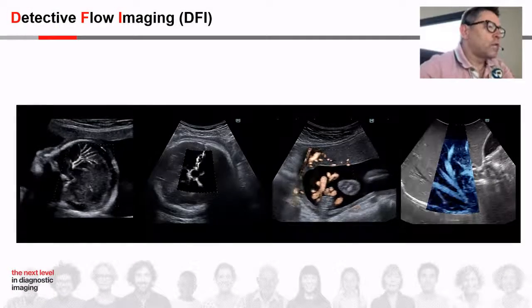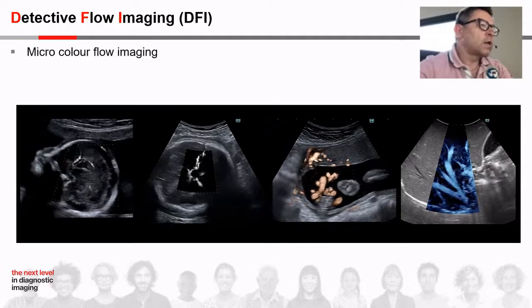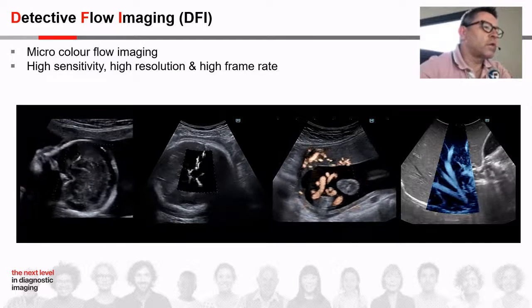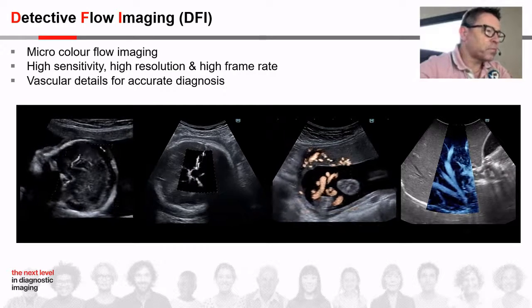I will introduce you DFI. DFI is a micro color flow imaging that both provide high sensitivity and high resolution with high frame rate to depict vascular details and obtain easily an accurate diagnosis.